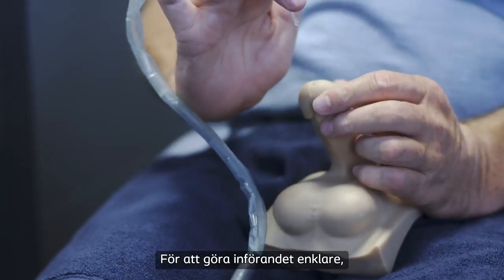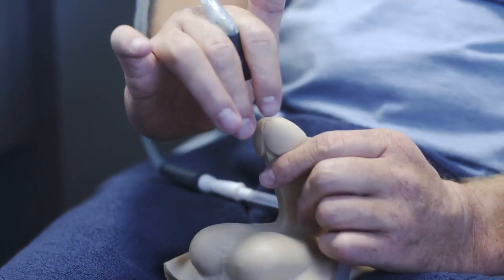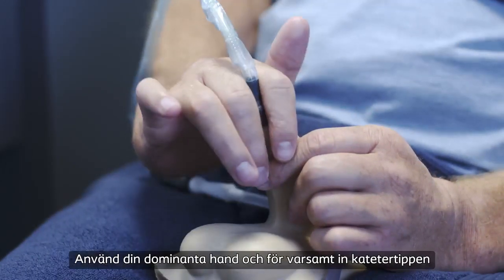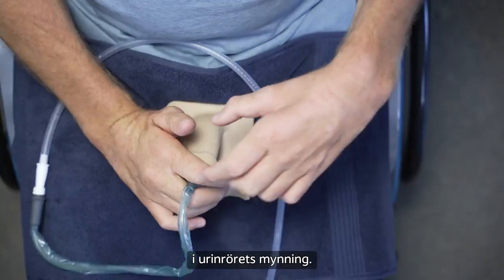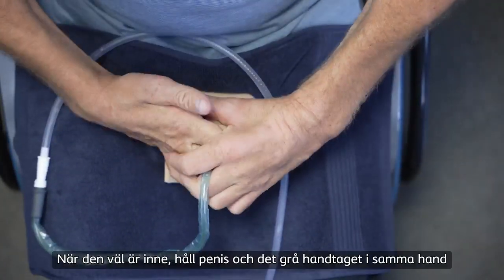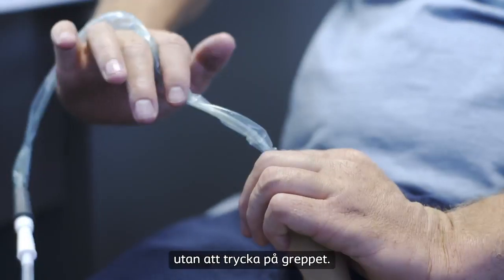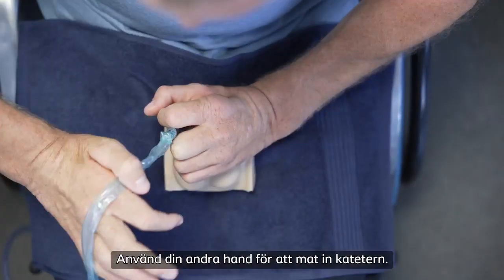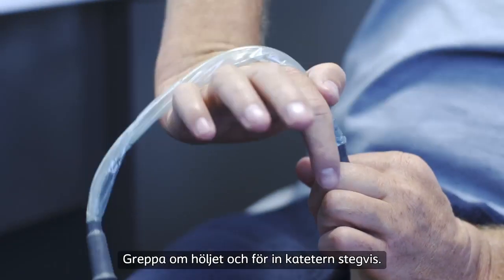To control the catheter during insertion, squeeze the soft part of the grey handle. While supporting your penis with your non-dominant hand, use your dominant hand to gently guide the catheter tip into the opening of the urethra. Once it's inside, hold your penis and the grey handle in the same hand without applying pressure to the grip. Use your other hand to insert the catheter. Pinch the sleeve and gradually pull it towards your penis.